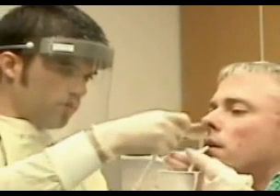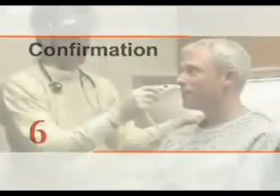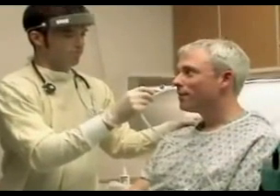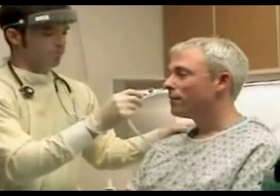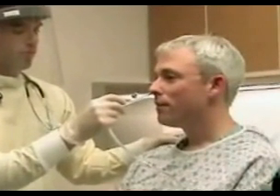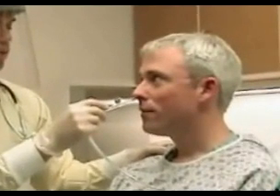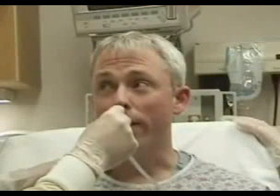Check the black markings on the tube to confirm proper depth of insertion. Assure that the patient is in no respiratory distress and is able to speak. If the patient is unable to talk, is in respiratory distress, or if respirations can be heard through the tube, it should be removed immediately as tracheal intubation has likely occurred.